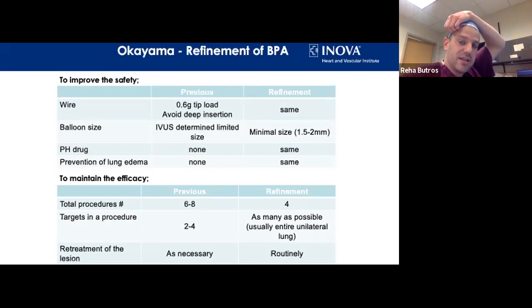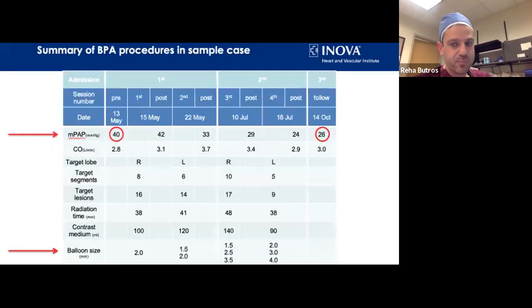In the past, when they were doing this initially, about 10 years ago, they were using intravascular ultrasound and sizing the vessels based on it, so they were matching the size of the vessel with their balloon size. Now, if you do that, you're going to have much more complications. So now we just start with a small balloon and create multiple channels in the vessel, which leads to decreased pressure, and then we gradually increase from 2 millimeter to 3, 4 and 6. Initially they were using the true size of the vessel, and the vessels were not responding well to that.